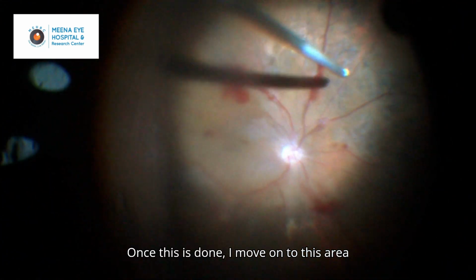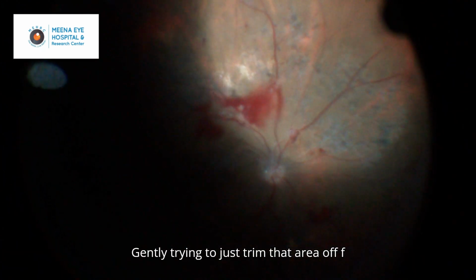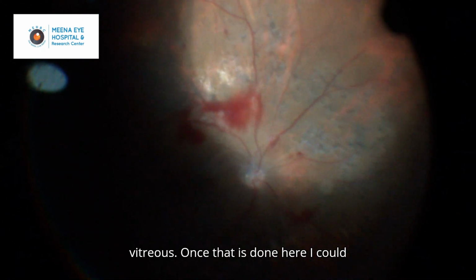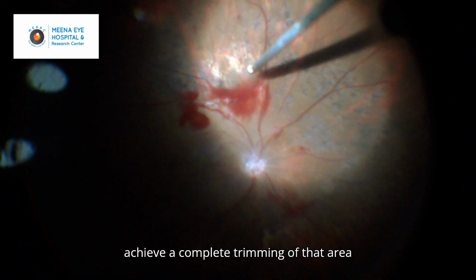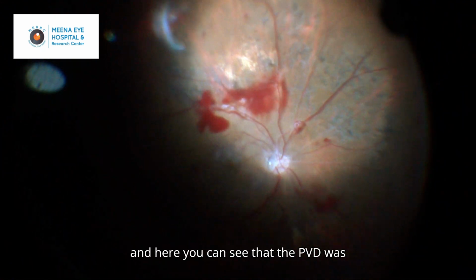Once this is done, I move on to this area which had a lot of neovascularization. So I'm gently trying to just trim that area off from the peripheral attachment of the vitreous. Once that is done, here I could achieve a complete trimming of that area, and here you can see that the PVD was complete.